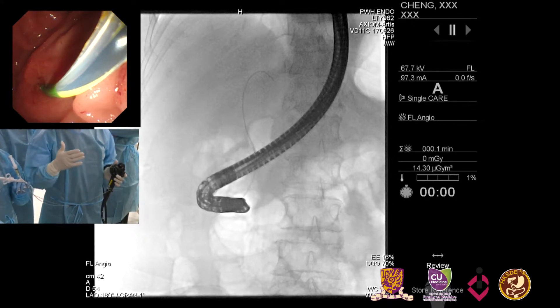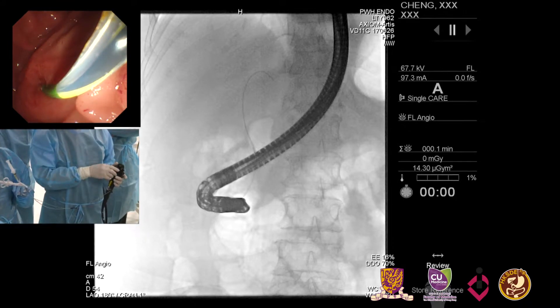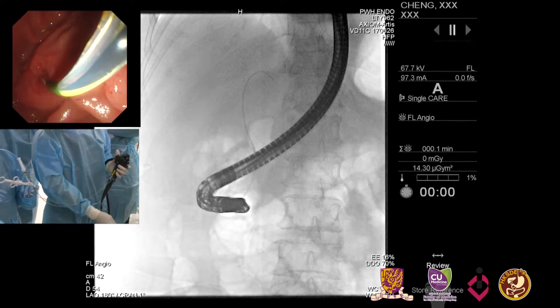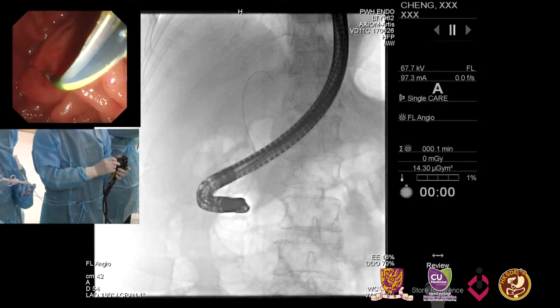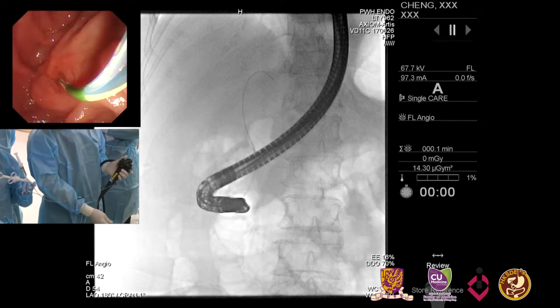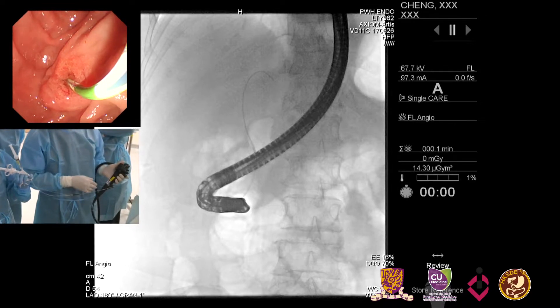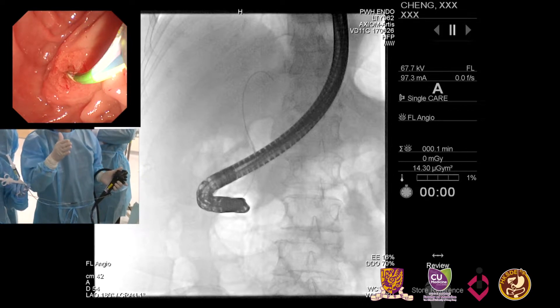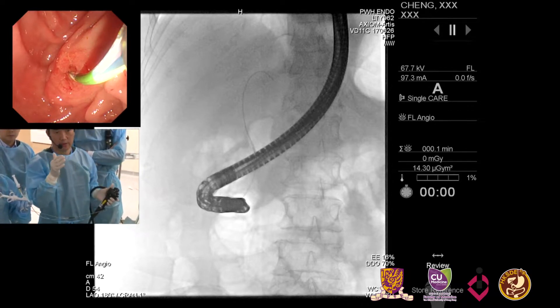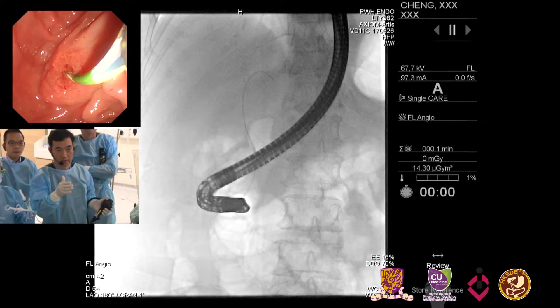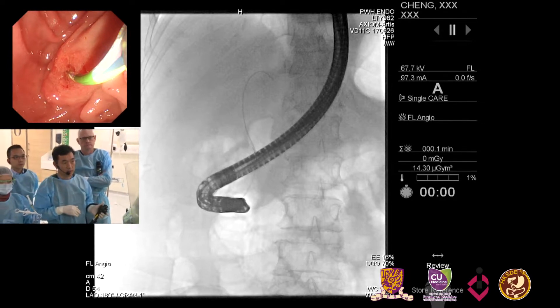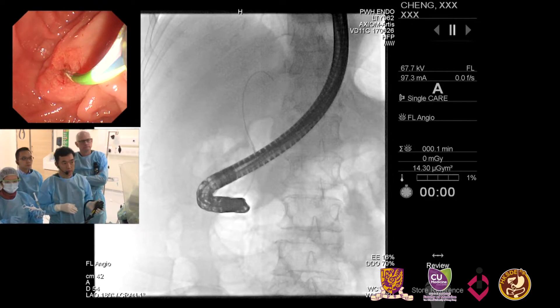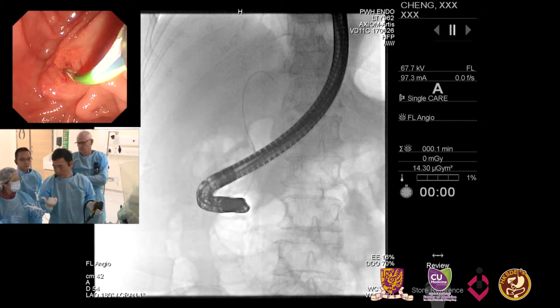Today there was a temporary stent placed and I removed it already. She has a little bit distorted duodenal anatomy, so for cannulation I have to make a little J-shape to face the papilla. Once the alignment to the bile duct is straight, then we cannulate it and the wire is extended. The wire is right now in the left intrahepatic.